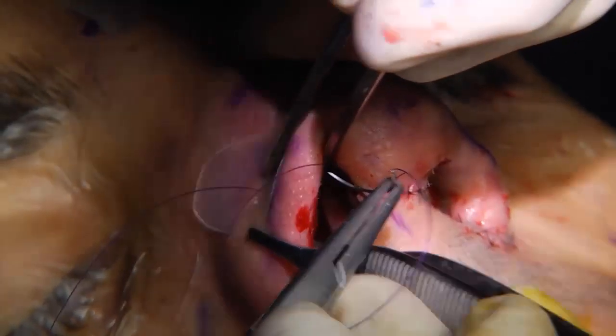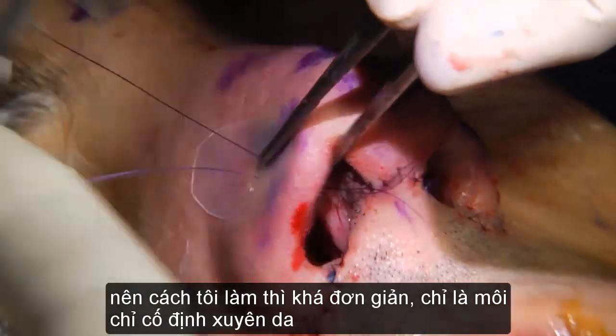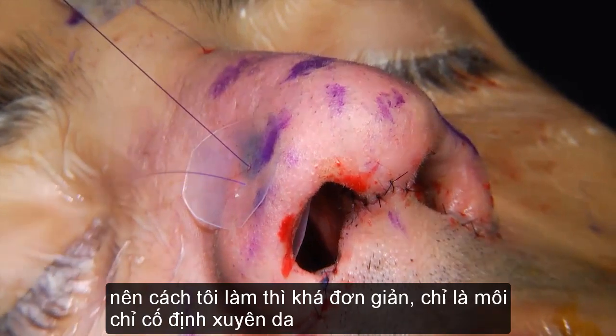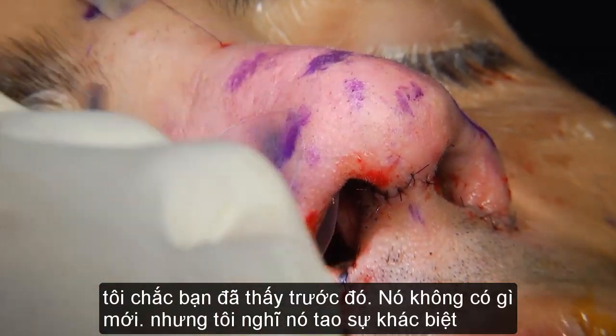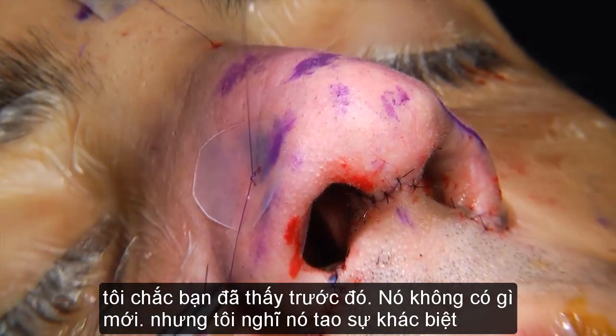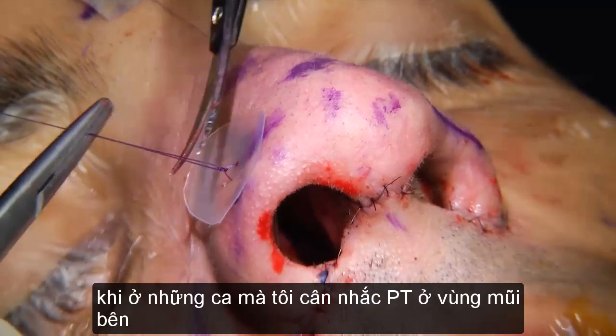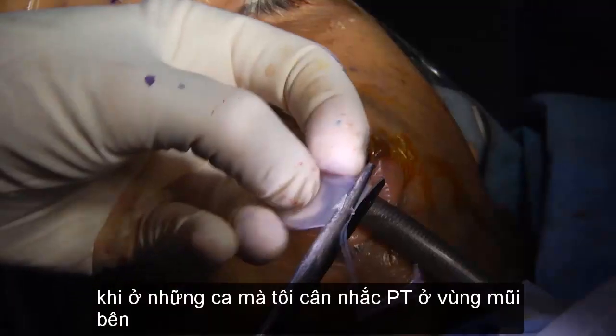Okay, it's enough. So the way I do it is as simple as that. It's a transfixion thing. I'm sure you've seen this before. It's nothing new. But I think it makes a difference in cases where I do considerable surgery to my sidewall.